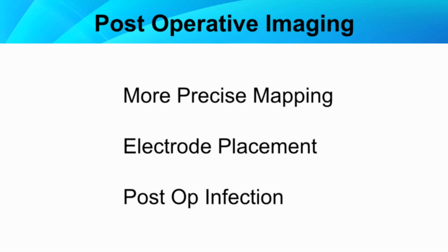A more common use of postoperative imaging, almost always CT, is determining whether or not the electrode is within the cochlea. Sometimes an electrode is misplaced at the time of the implantation procedure. This is readily identified on imaging. Plain films can be used intraoperatively to verify the correct placement of a cochlear implant electrode array. Plain films or CT can be used postoperatively to determine whether the electrode array is in the cochlea, middle ear, or internal auditory canal, which can happen in some dysplastic cochlea.